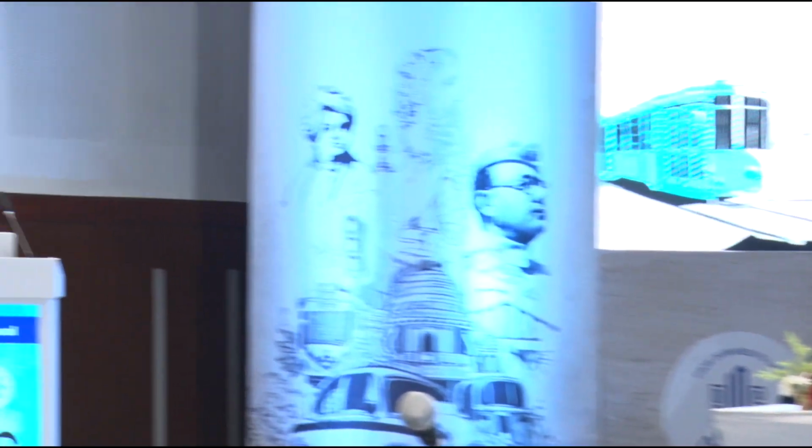Huge difference, sir, especially in a high volume retina practice. There's a human fatigue factor in every patient. I cannot do the same meticulous indirect in my first patient and the same meticulous indirect in my 60th patient. So sometimes you tend to miss things, especially in uncooperative patients. Sometimes the technician also says, sir, I can see a hole in the supratemporal quadrant, and you again see the patient, and actually there is a hole which you missed because of the fatigue factor. So you have to be objective in documentation, and this helps a lot.